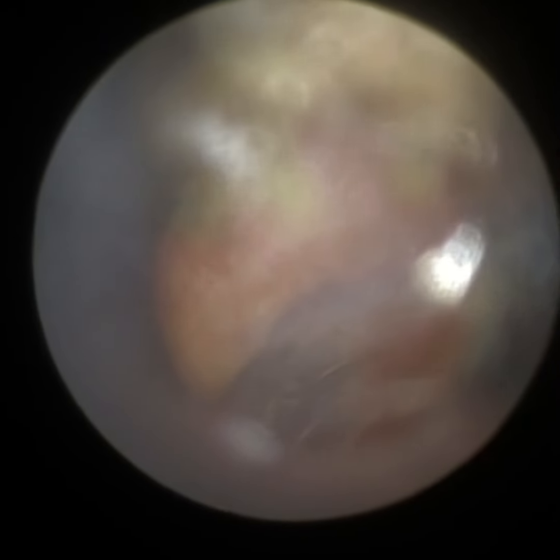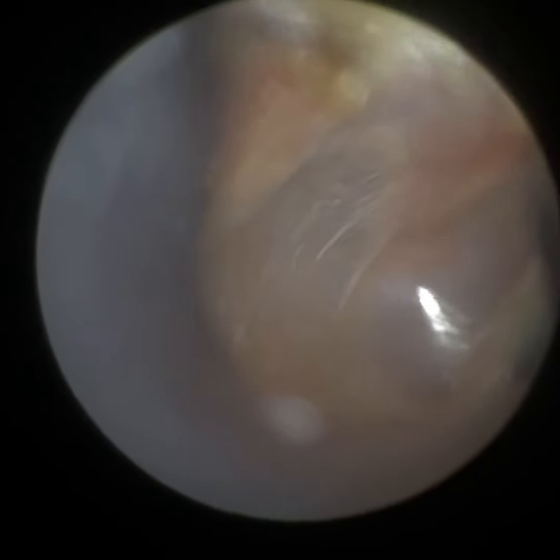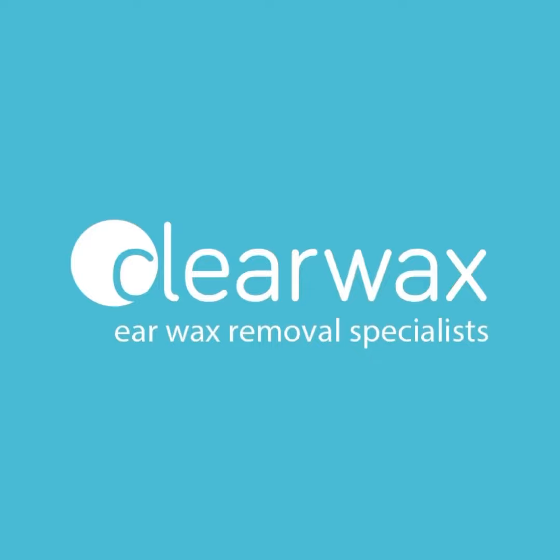This patient's got a very, very bendy ear canal. This is probably why, in hindsight, the 3.5mm speculum would have been better. But we can still see the whole eardrum — I've managed to straighten that ear. The eardrum's nice, healthy, visible, and intact.